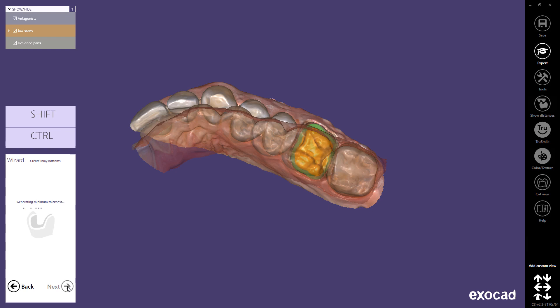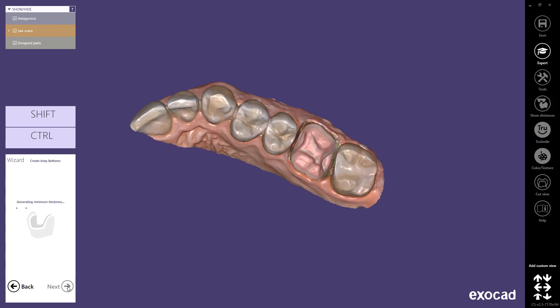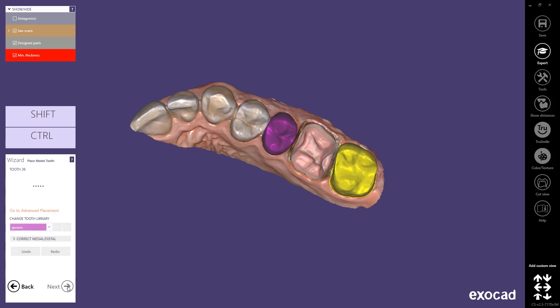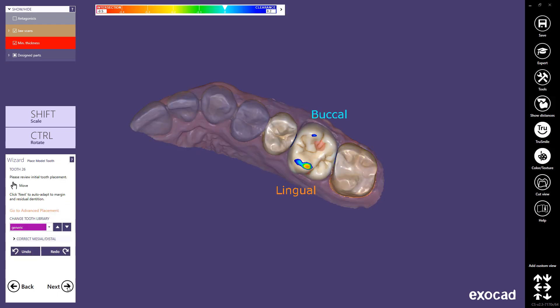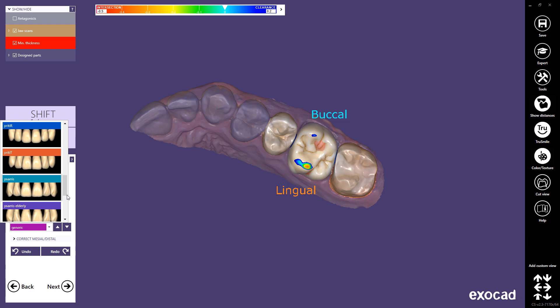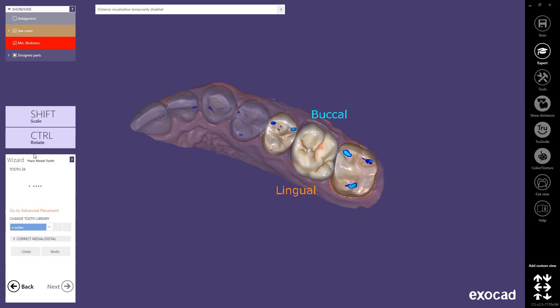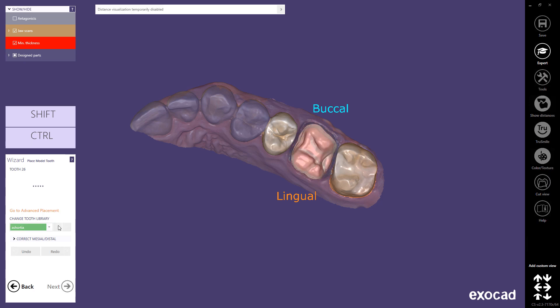Chairside CAD automatically calculates the cement gap of the crown bottom using the scan data geometry and the defined margin line. Material-specific parameters are considered in this calculation. It also detects the orientation of the crown. Using the library drop-down, you can change the tooth library, or you can navigate through the library by using the arrow buttons.